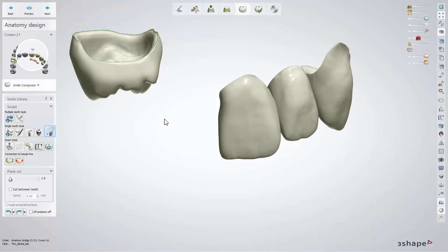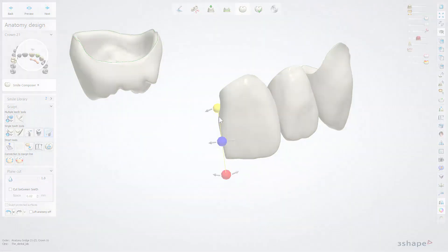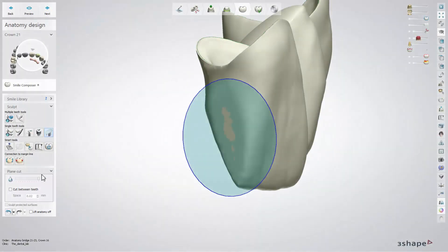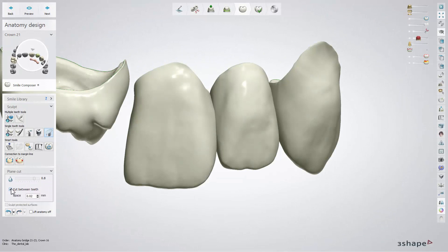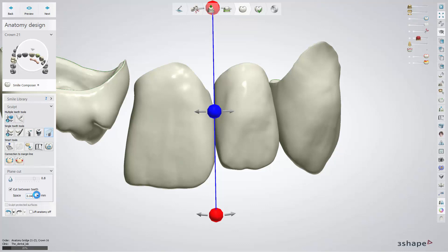The Plane Cut tool allows you to cut your restoration with a plane. You can move and adjust the plane by using the spheres. The smoothing parameter lets you adjust the amount of smoothing of the cut edges with the slider. In case of two neighbouring teeth being modelled, you can check the cut between teeth checkbox and define the width of the cut in the space field.